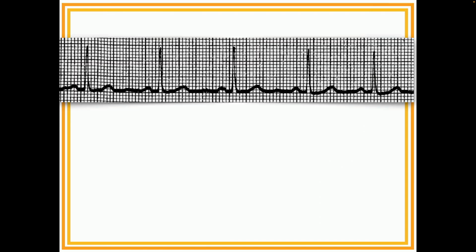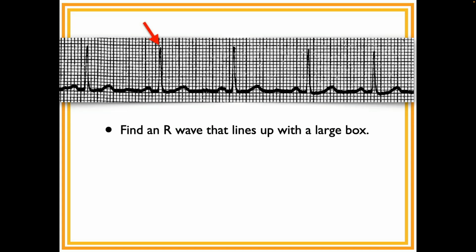Okay, so here's our strip, and it's only part of a strip because I wanted to blow it up. Which one do you think is closest to one of the large box lines? Yeah, I think the second one is. There's none that lie exactly, but this one right there is really close, okay? Everybody see that? Then we start counting how many large boxes to the next.